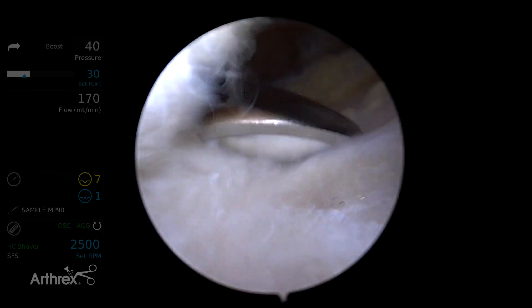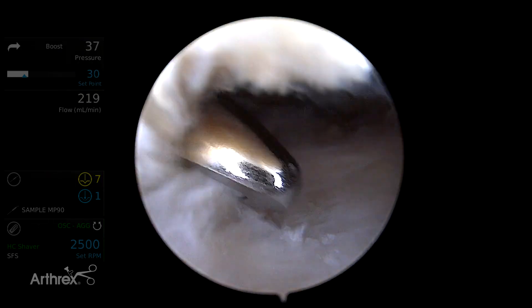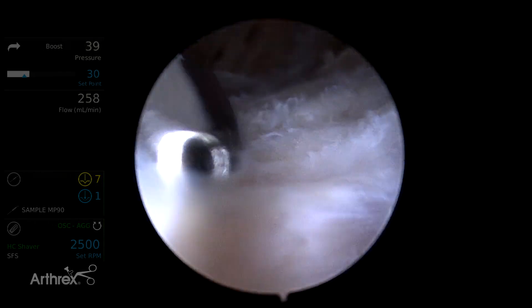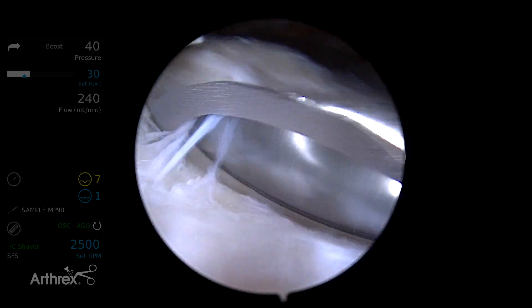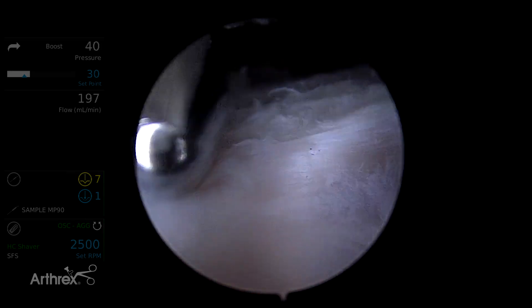When doing these in the operating room, I usually want to take enough bursa so that I can find our tear. I don't want to take too much because I don't want to get into any bleeding. If you're doing this in the operating room, that's one of the more frustrating parts of exposing your rotator cuff — if you're getting bleeding early on, it can really slow your case down.